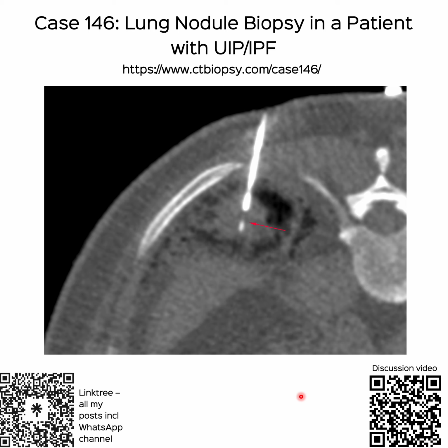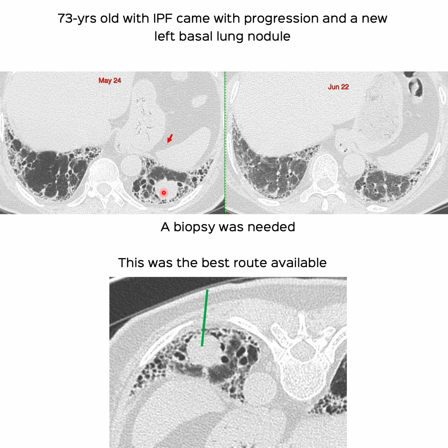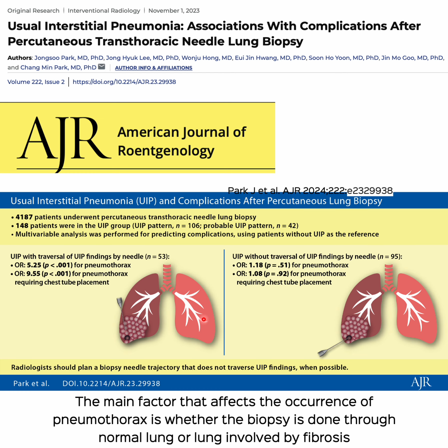Lung nodule biopsy in a patient with UIP-IPF. I am Dr. Bhavin Jankaria, and this 73-year-old with IPF came with progression of disease and a new left basal lung nodule. A biopsy was needed. This was the best route available.